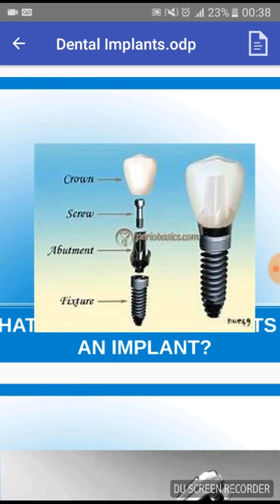Because I see titanium used very commonly, I'm going to mention titanium. So titanium is good because it's low weight with a high strength to weight ratio. The modulus of elasticity is actually half of stainless steel. And as you remember, you should be rattling it off now, the modulus of elasticity is the number that measures an object's or substance's ability to resist being deformed elastically, i.e. stretched. Okay, so it forms a protective layer over the actual titanium, and this protects it from further oxidation.